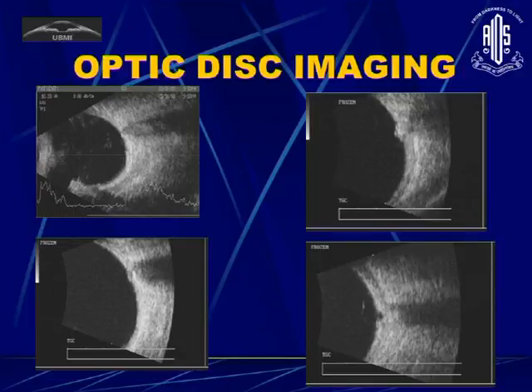On the optic disc area, it helps us to pick up very early optic disc cupping. This may be missed on the 10 megahertz probe. You can see an optic disc drusen, whereas on a 10 megahertz, there can be hardly anything to be seen very well.